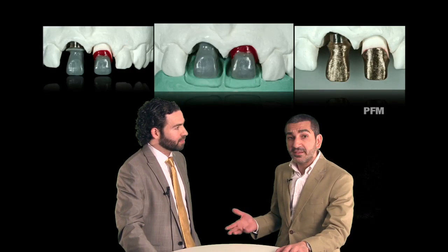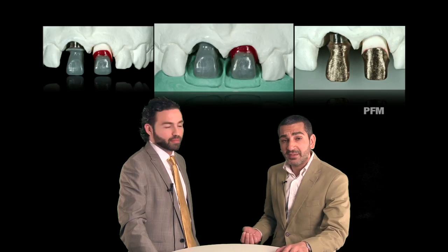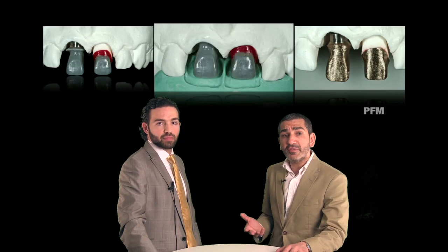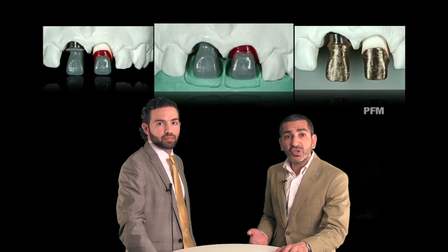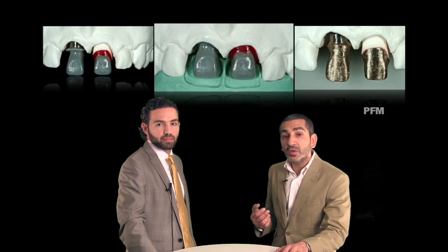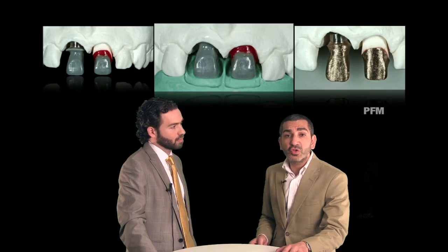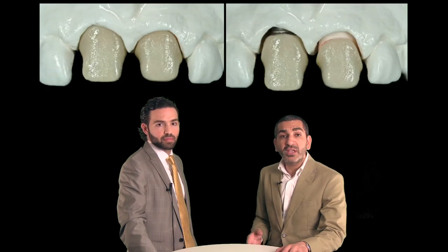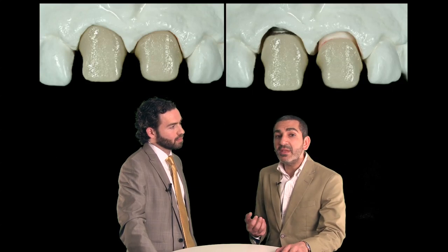Well, in this particular instance, again, one important issue is the cutback. We need to be able to provide our technician with adequate space. Now, obviously, we have adequate space on the implant because the technician has full control of it, but adequate space on the natural tooth is provided by proper reduction with the aid of a diagnostic wax up, and the technician uses that as a reference and can easily match those two abutments at the same time. They're made out of this high gold alloy type of material, and the gold alloy gives you that warmth, that natural dentin color that emanates from underneath.